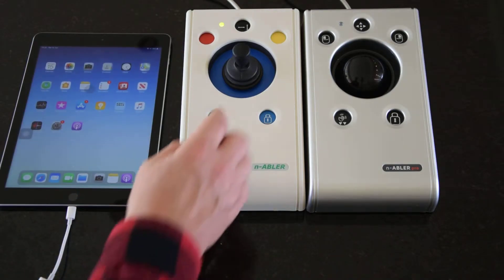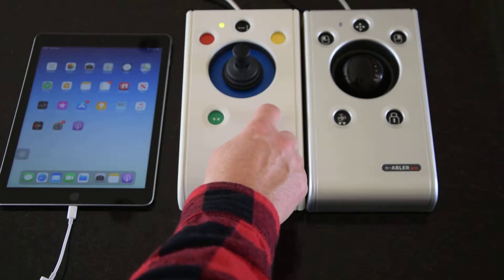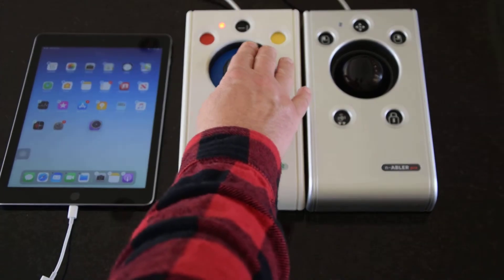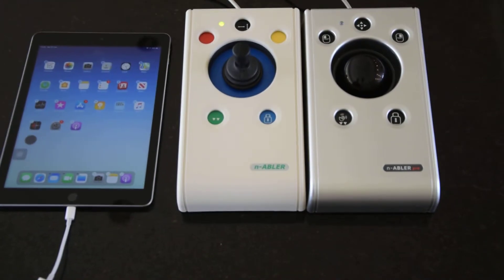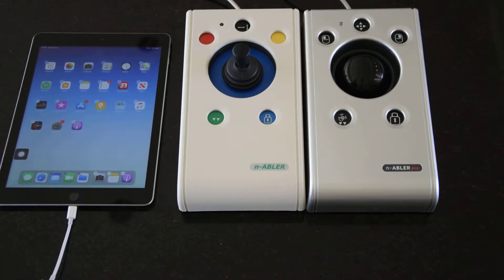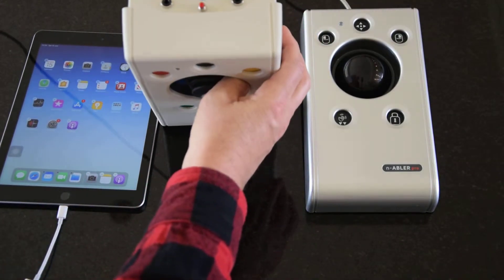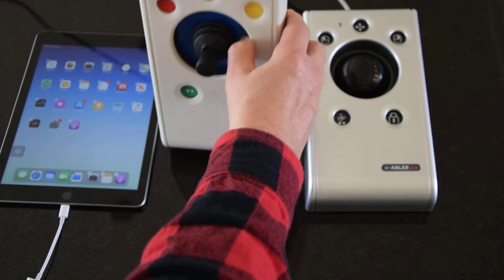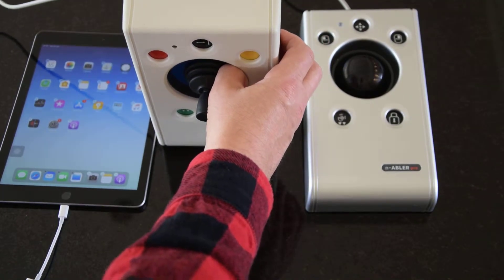The drag feature is also quite useful for moving icons around. Turning on drag, you can drag an icon around, and press again when finished. The Enabler joystick is also switch adapted — there are two sockets at the back, and you can program what they do, choosing from any one of six features: the five buttons at the front plus the speed setting at the back.